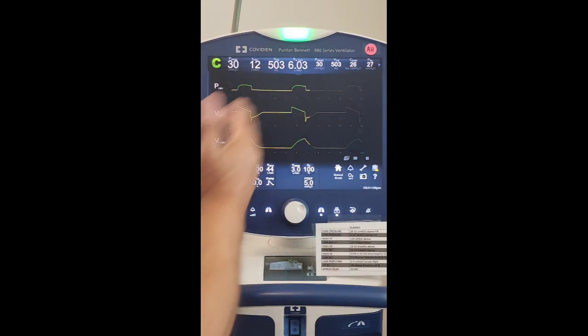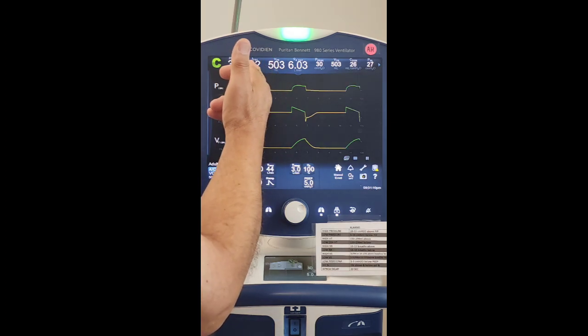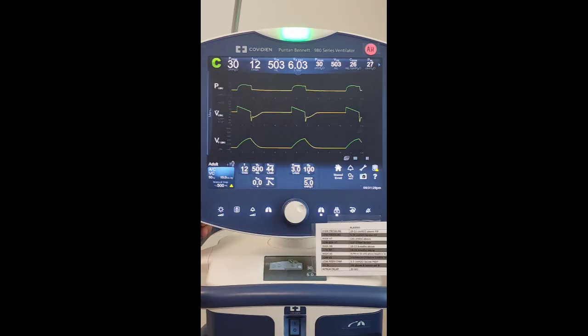Everything's going to look like this: respiratory rate 12, tidal volume 500, minute ventilation 6 liters. If you want to put 6.03, 503, that's fine, nothing wrong with that. And you have your plateau pressure, you have your PIP. But for this lab, I'm going to want you to start out with a pressure control of 15.